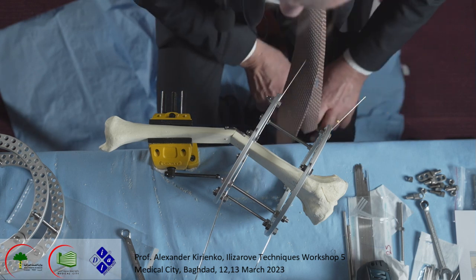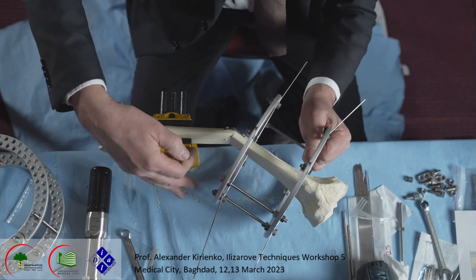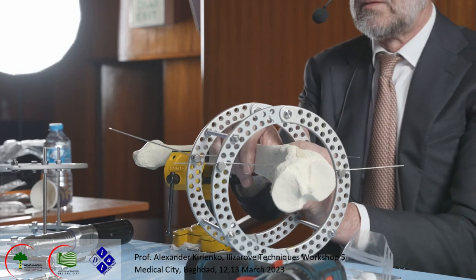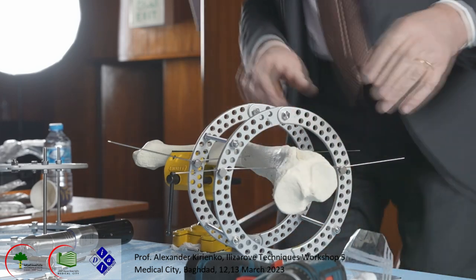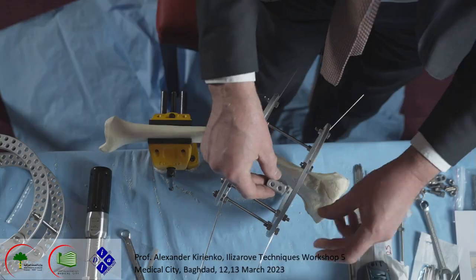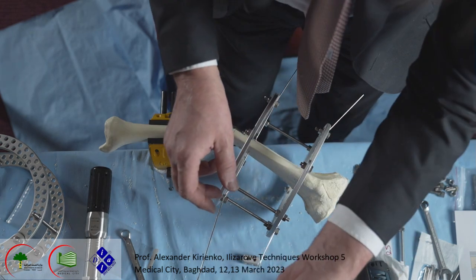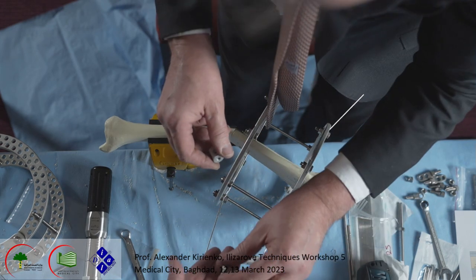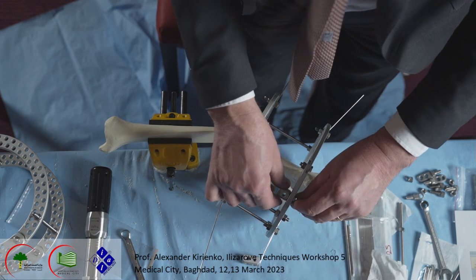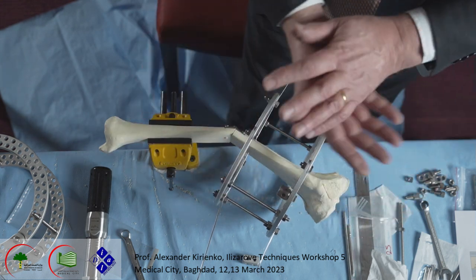Okay. And now, just like you see, it's a little bit stable, not so much, because two wires are not enough. Okay, centered. What we do, we put a half pin here to have a more stable system. I think we may put it here, one hole. It's okay. This half pin will be on the medial side, anteromedial to the tibia, like this.